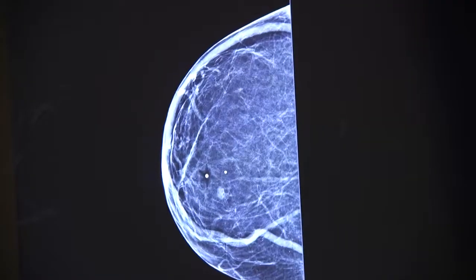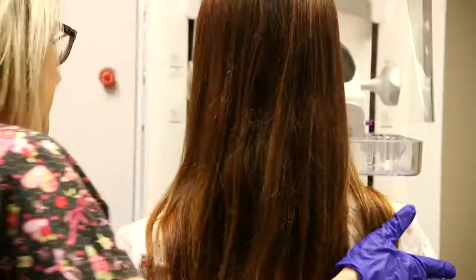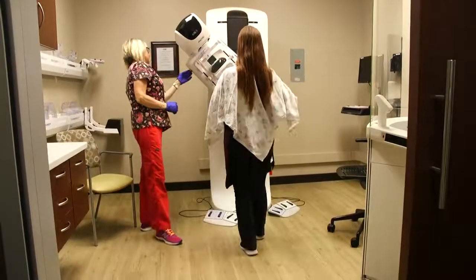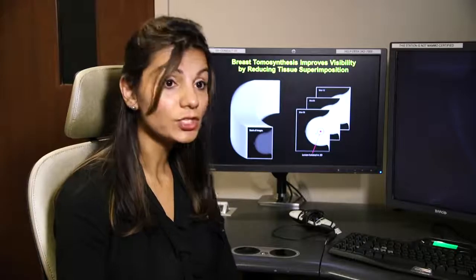A mammogram is typically a 2D machine that takes pictures of breast tissue. This is going to be, you know, at the level of grains of sand, and I think that's important to look at. We're going to start feeling it maybe at the size of a pea, an olive, or a grape-size lesion. And that really changes the management.